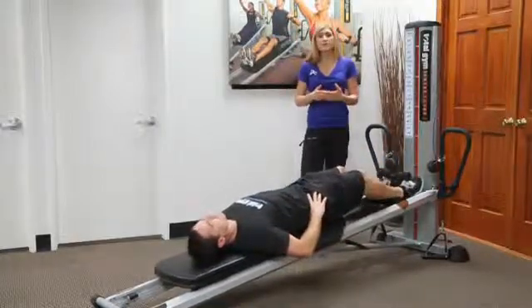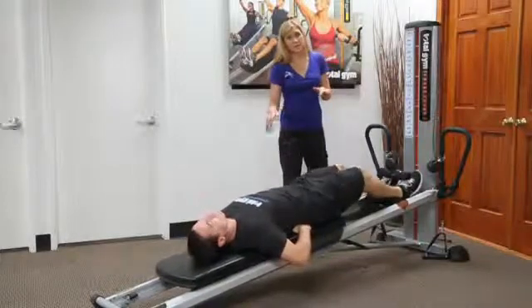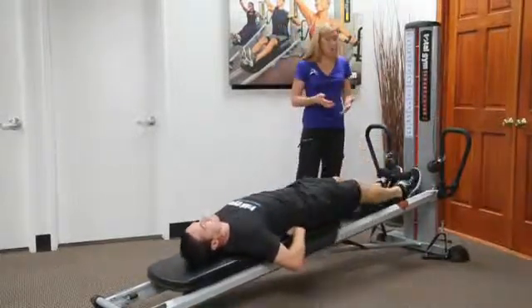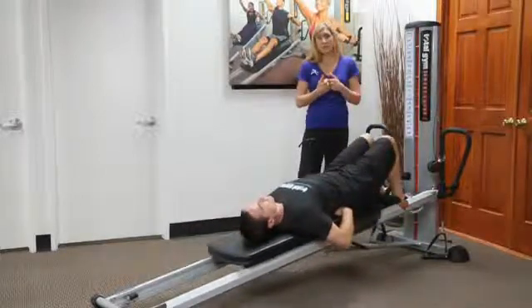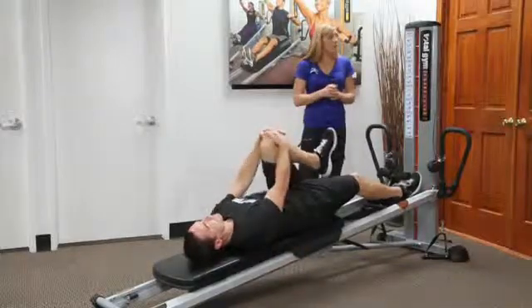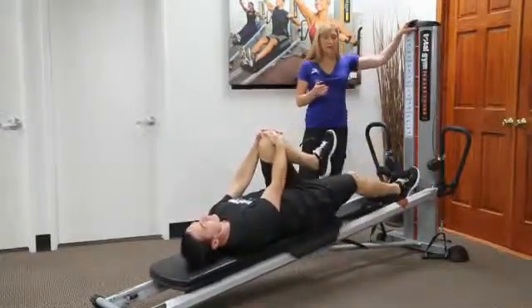However, oftentimes I see my patients really arch their back and they lose that spinal stabilization. So to help increase the resistance, what I can do is just bring one knee into their chest, and that helps with stabilization. And I'll reiterate that as well. If, for instance, they need to come down an incline, I can always lower them.